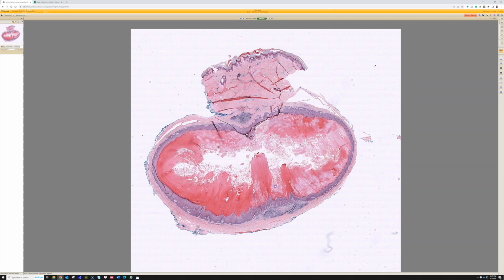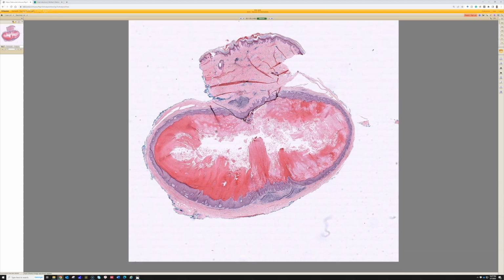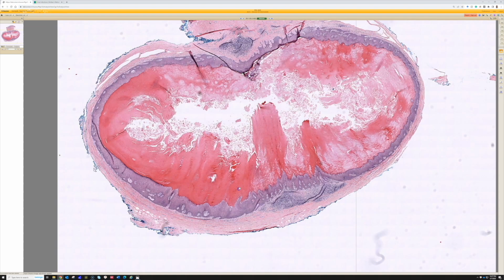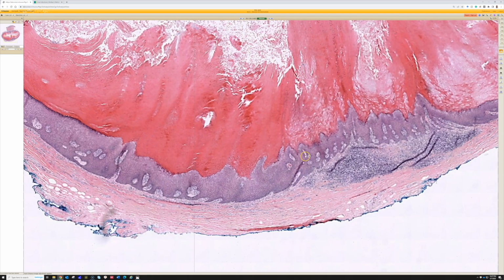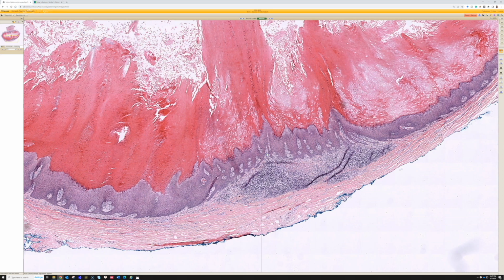But in any case, whatever name you like, it looks like a keratin-filled benign cyst. So it would be good for an epidermoid cyst, but there's something a little extra and special here. When we look at the epithelial lining of the cyst, it does look like epidermis, like you'd see in an epidermoid cyst, epidermal inclusion cyst, or follicular infundibular cyst, if you like that name.